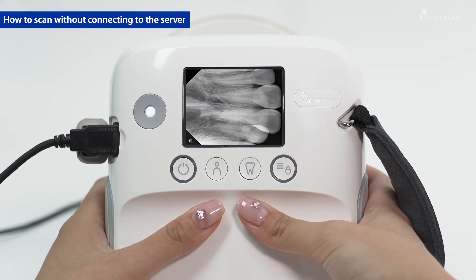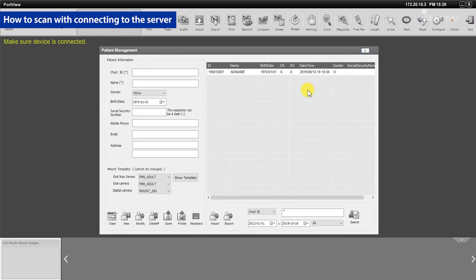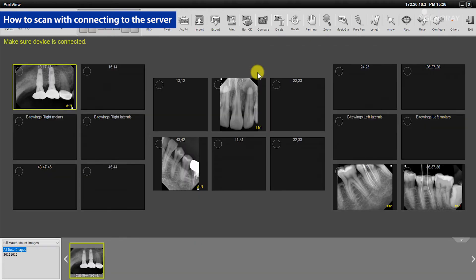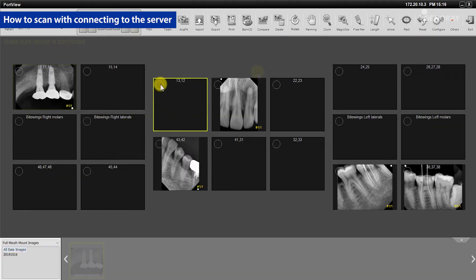Review the images directly on the LCD screen after the scan is finished. In PortView, register a new patient or select an existing patient, then prepare scanning from PortView.